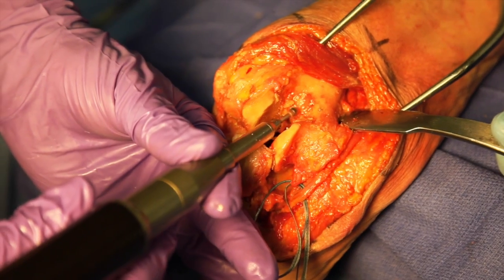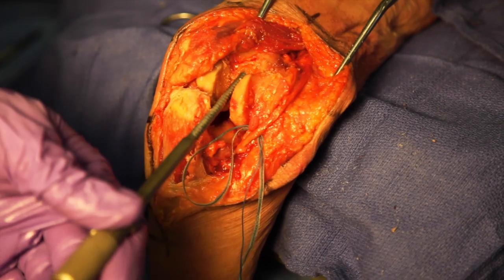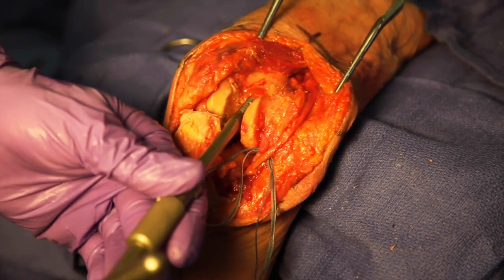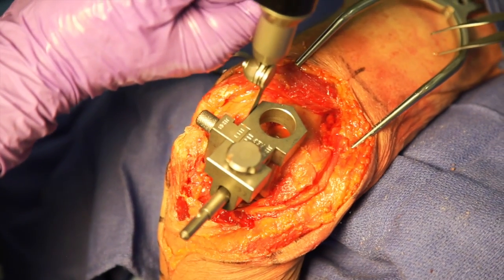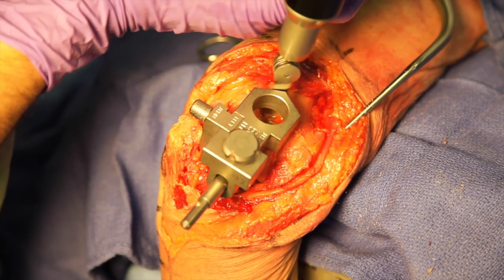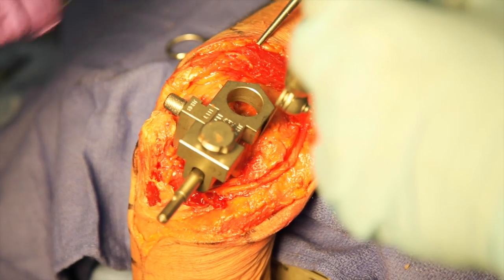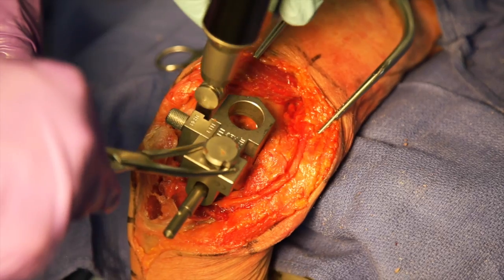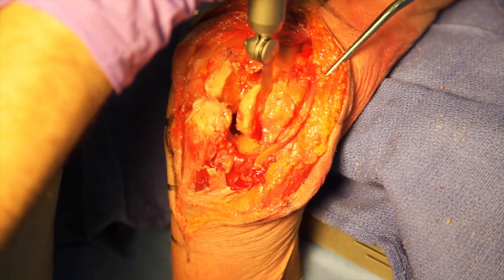A high-speed burr is used to gain access to the medullary canal of the humerus. The humeral alignment guide is then inserted with the aid of a T-handle and malleted into place. The humeral cutting guide is then attached to the intramedullary alignment guide. The cuts are defined using an oscillating saw. The alignment guide and humeral cutting guide are then removed.